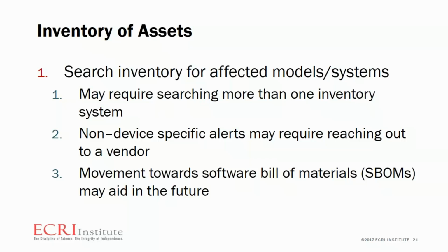And there's movement towards software transparency. Basically, if you have a device, it'd be good to know the parts under the hood, and there are initiatives to be more transparent about this, including an upcoming revision of the MDS² form that would ask if there actually is a software bill of materials, or SBOM.